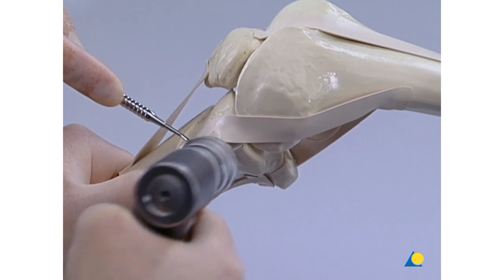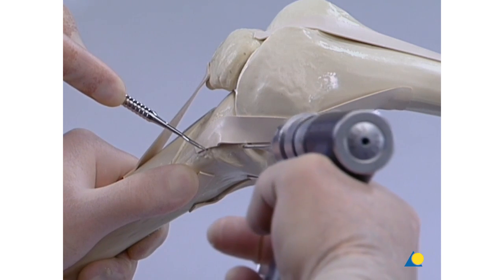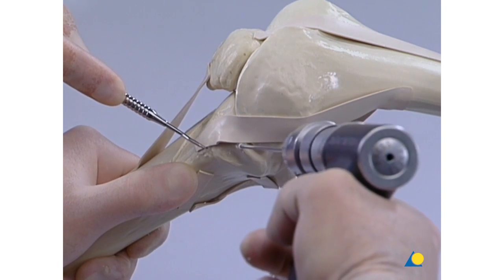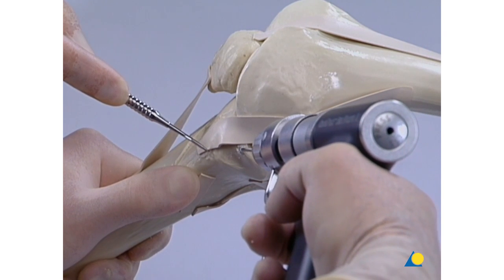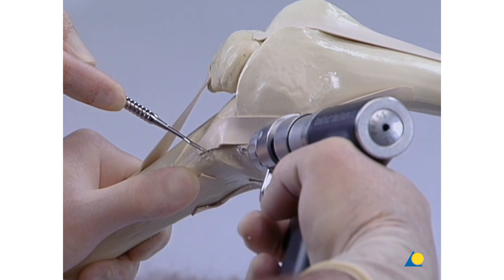Preliminary fixation is done by inserting a K-wire. This preliminary fixation is begun close to the joint surface. Then the K-wire is angled downwards so that it ends in the tibial shaft.